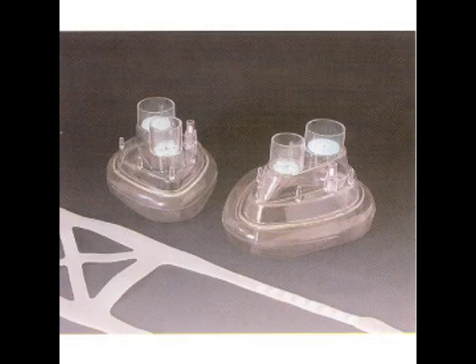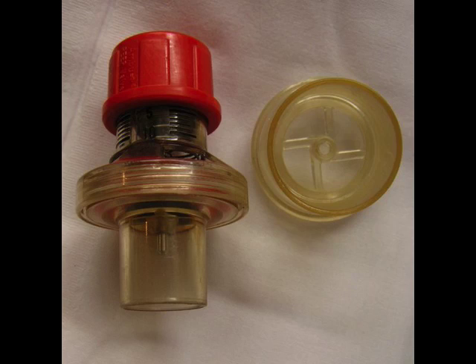Years ago, positive pressure was applied with a system like this. You see, this is a pressure mask that can fit over the patient's mouth and nose. There are two one-way valves on it. One of the one-way valves is an inlet. It allows a gas flow of greater than 30, 40 liters per minute, enough to meet the patient's inspiratory demand, but they couldn't exhale that way. They'd exhale through another one-way valve, which was then connected to a spring-loaded PEEP valve.